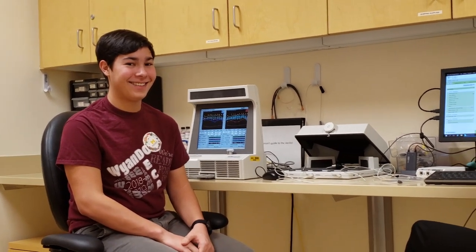So for your voice, does it seem louder? My voice just sounds — I don't know — I sound like I can actually hear my voice now. It almost feels like it went from artificial to like I'm actually hearing my voice. Like when you hear your voice in a recording, you think it's totally different than what you're hearing. So you're hearing your actual voice now, what you actually sound like. Yeah, good.